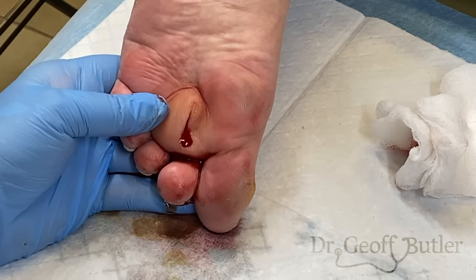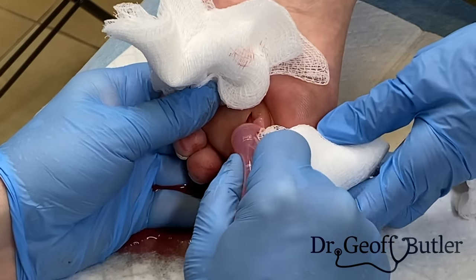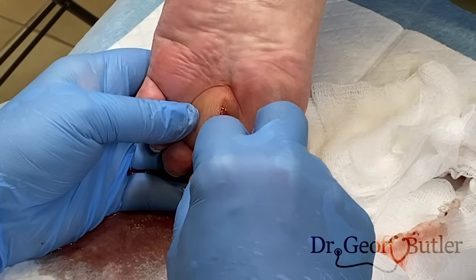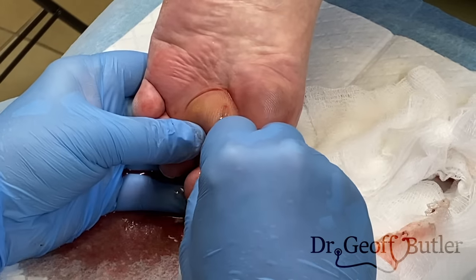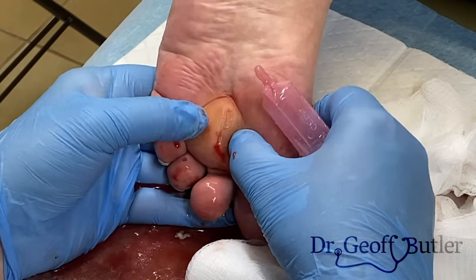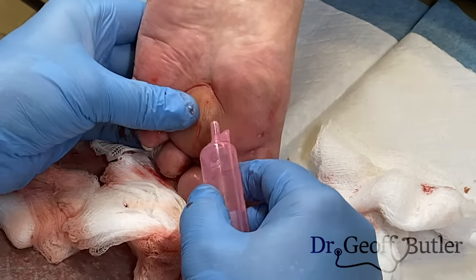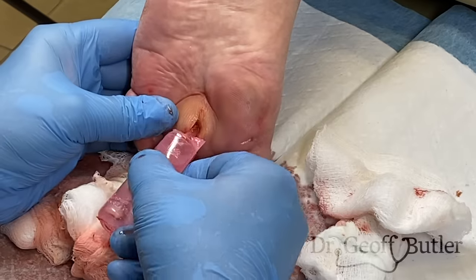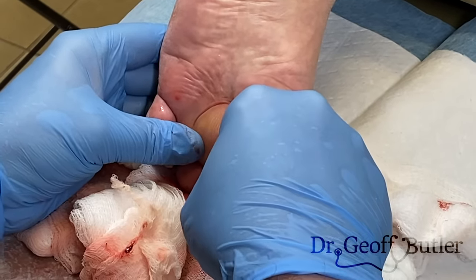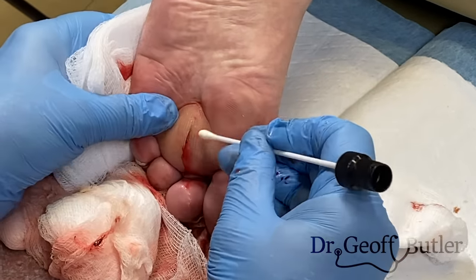I'm going to irrigate this now — I'm going to put some fluid into it. Can you get me a swab as well please? So essentially I want to change direction, syringe it out, and clear as much infected tissue as we can. From a swab perspective, we want to clean that out as much as possible before we do our swab.